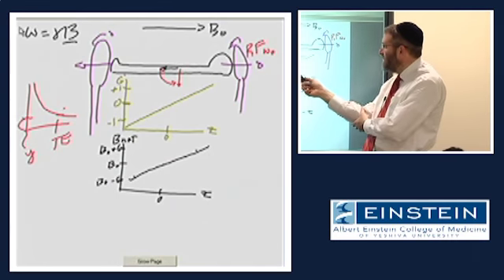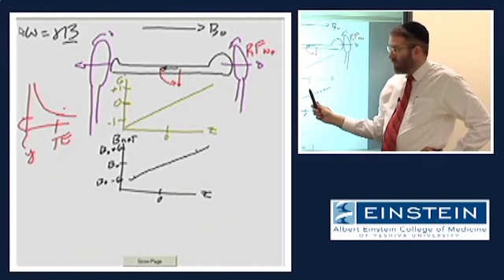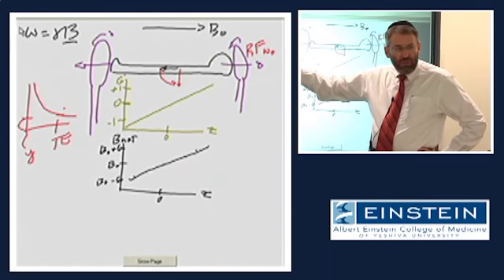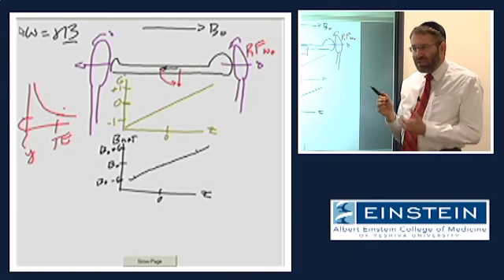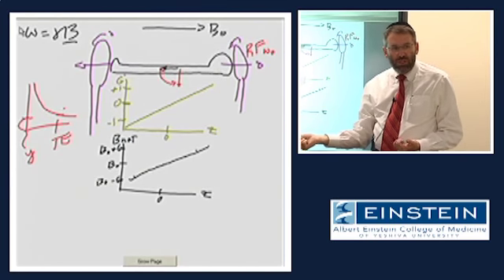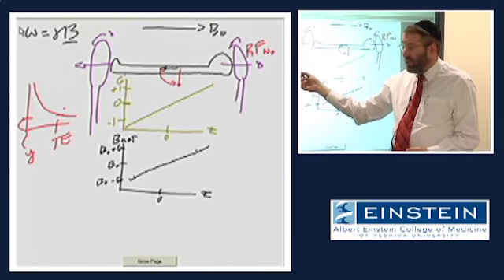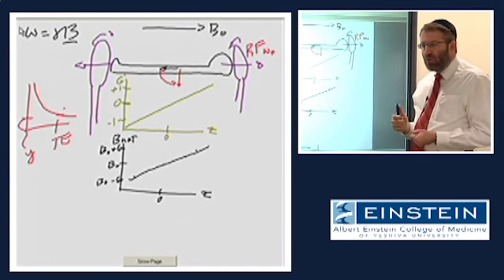But in the presence of the gradient magnetic field, anything north or south of isocenter is subject to a different net magnetic field strength. Therefore, it is going to precess at a frequency that differs from this precessional frequency, omega naught. And there's no resonance, therefore there is no efficient transfer of energy, and there is no flip or rotation of that magnetization. So when we measure the signal, what we sample is whatever signal happens to be in the bore of the scanner near our coil.